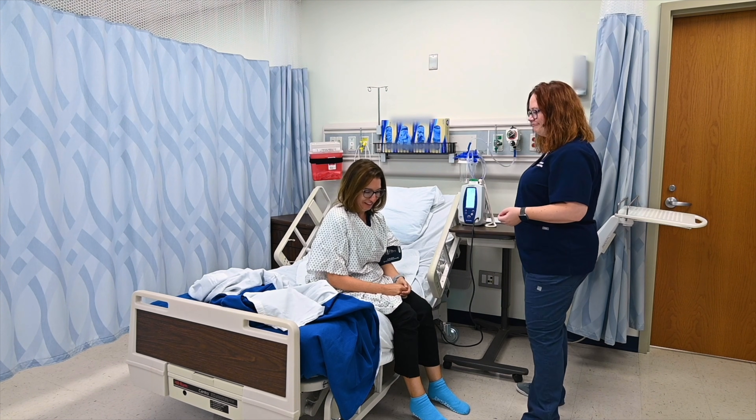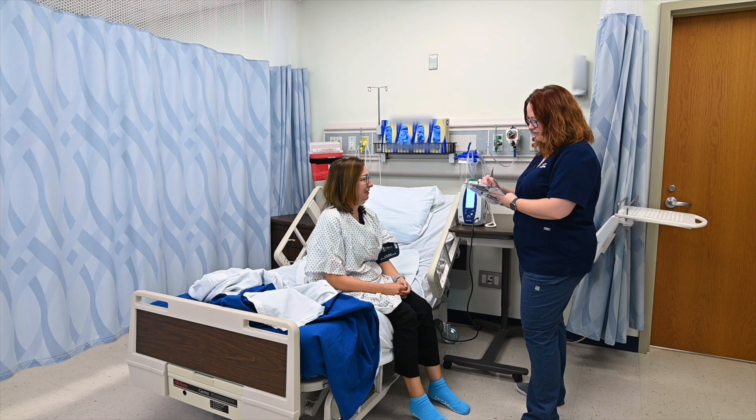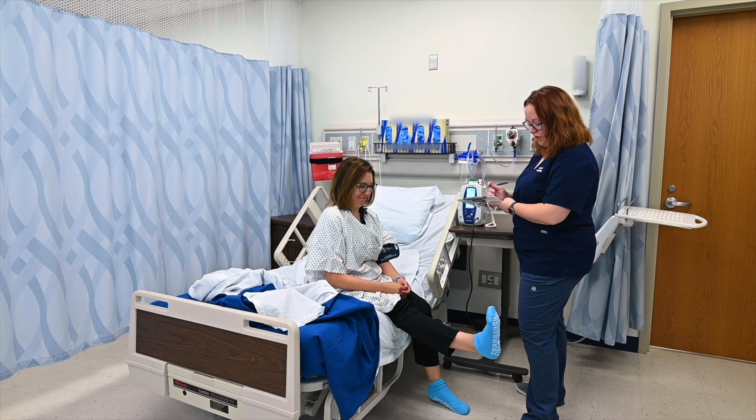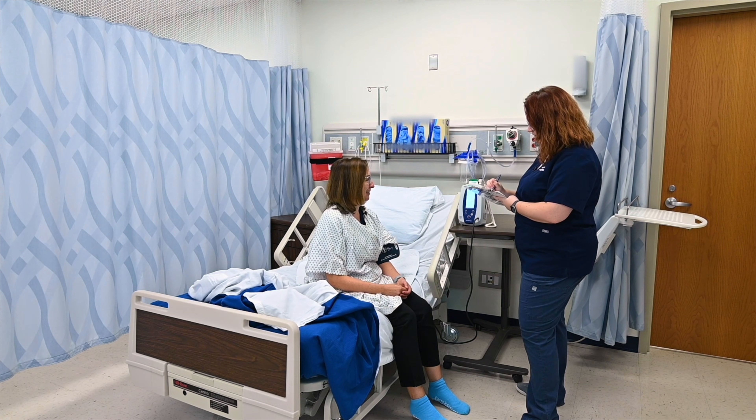How are you feeling sitting up? It's okay. Then once this is done, we'll go ahead and stand. I see you've got your no-slip socks on so we're hopefully not going to slip and fall. We got 125 over 81 and 58 for your pulse.